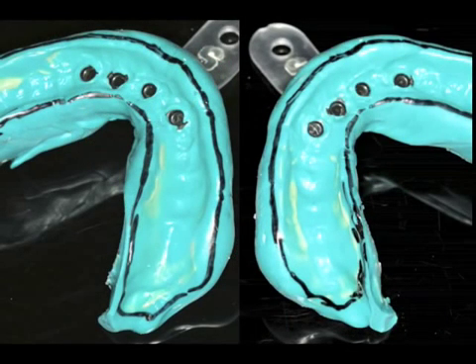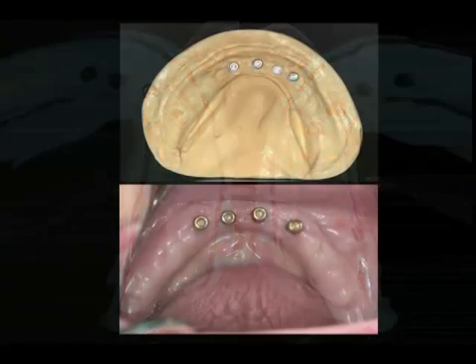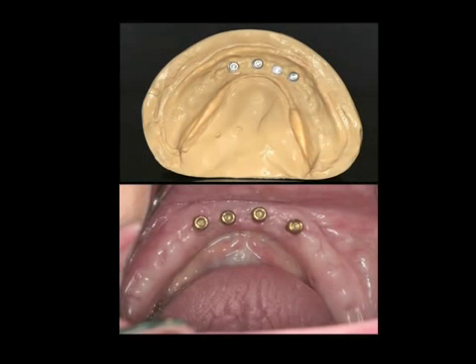Now it's a close-up. Look at the integrity of not only the ridge but the sulcus and the implants. This shows the cast and the tissue. These should be a replica of each other. Your final impression should reflect exactly what is in the mouth. This will eliminate most of the problems of postoperative soreness and will give you positive seating of the implant retentive elements.